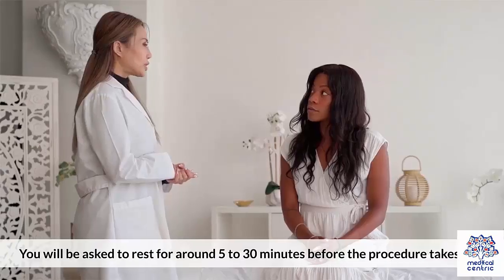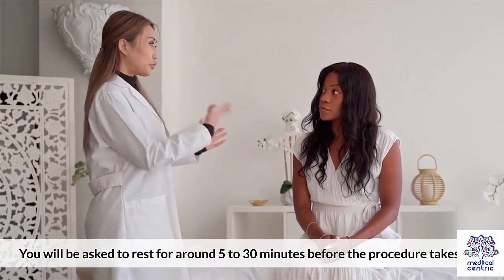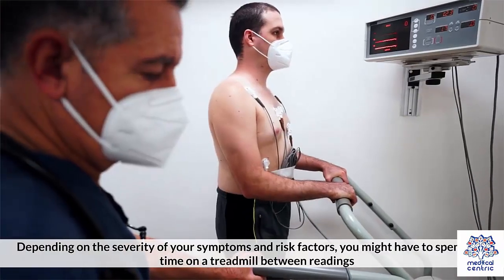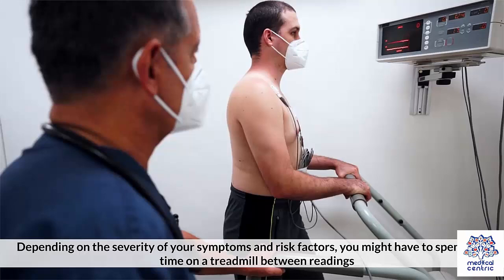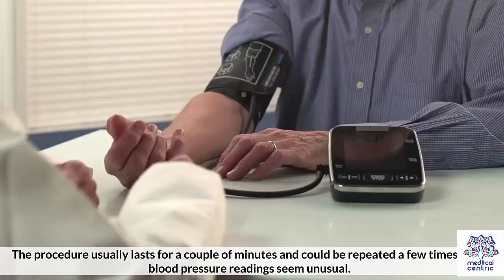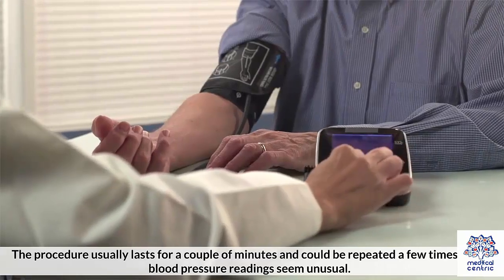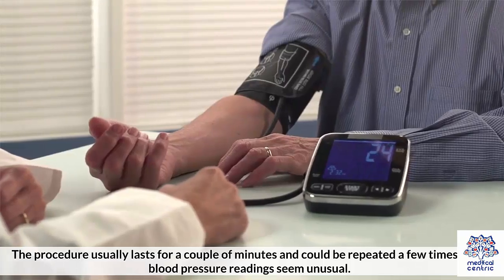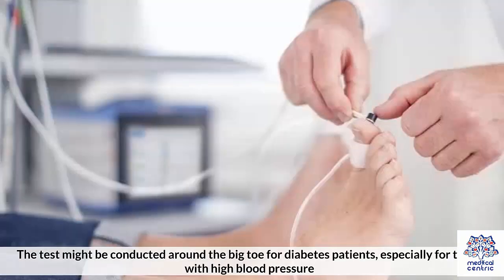The procedure: You will be asked to rest for around 5 to 30 minutes before the procedure takes place. Depending on the severity of your symptoms and risk factors, you might have to spend some time on a treadmill between readings. The procedure usually lasts for a couple of minutes and could be repeated a few times if the blood pressure readings seem unusual. The test might be conducted around the big toe for diabetes patients, especially for those with high blood pressure.